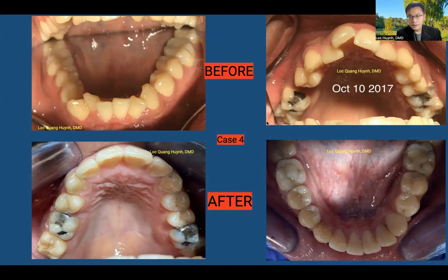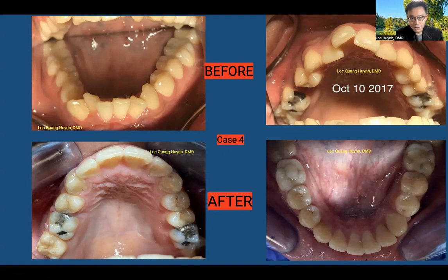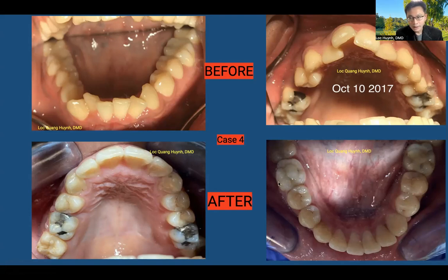I ended up finishing the case by closing the gap, straightening the teeth out, moving these teeth back a few millimeters and moving the molar forward — as you can see — and closing that gap. So he didn't have to spend the money for an implant. Occlusally, we were able to straighten everything out.